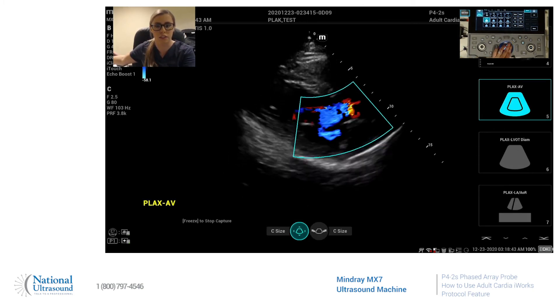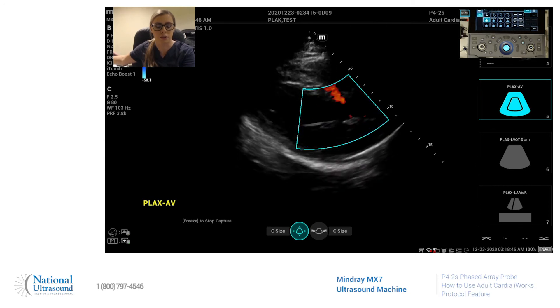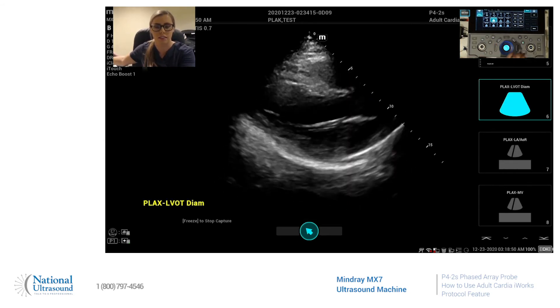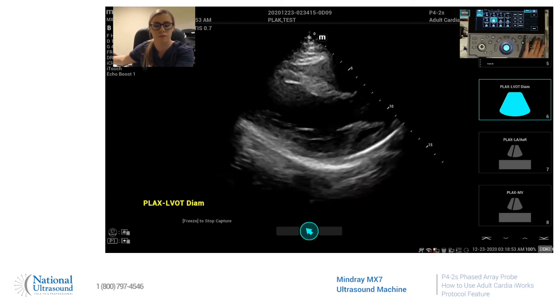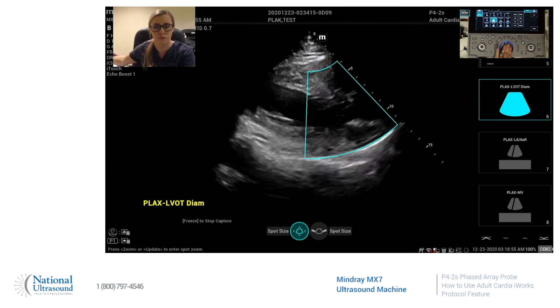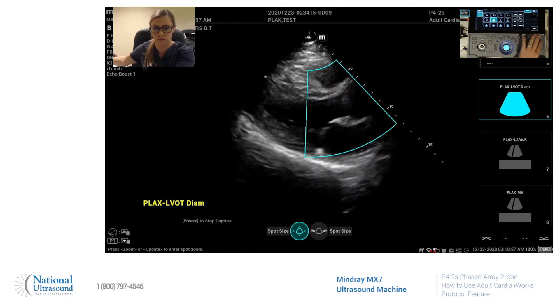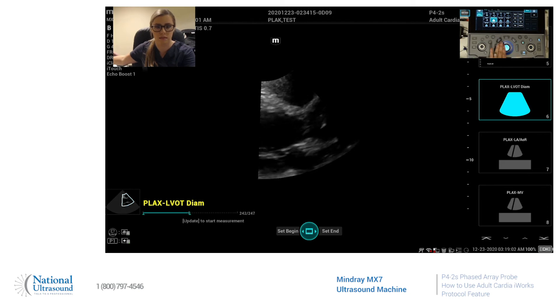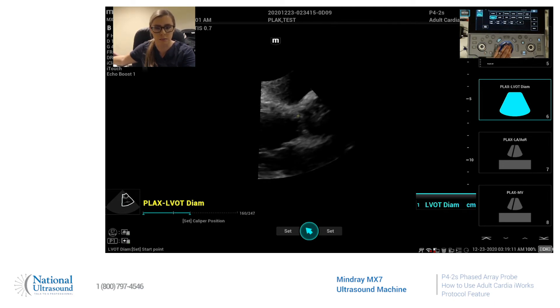Then you can put it over the aortic valve. You can zoom, and when you're ready freeze and move your image. Measure, and it brings up LVOT diameter. And acquire.